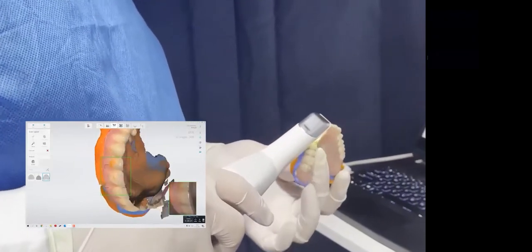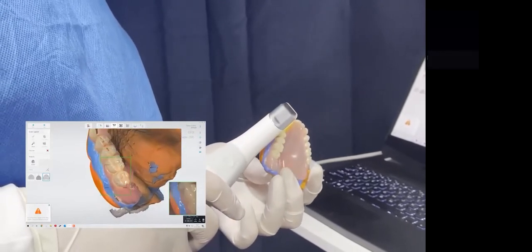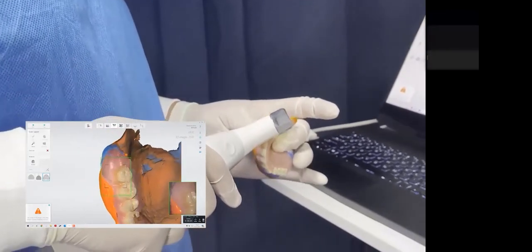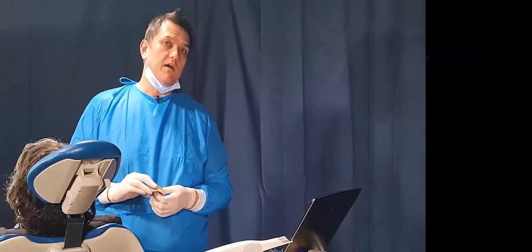But I'm just finishing off the tooth. And look, it's yelling at me. Scan's getting big, that's okay. Just don't stop. I think I said that in one of the articles we wrote recently. One of the tips that I've learned as you get to 2,500 scans: don't stop till you get enough. So don't stop until you've got everything you want on that scan. Now, that is your reference denture technique. So if you're a big proponent of compression, well, you've achieved compression, you've achieved digital. The bite is so accurate, so accurate.